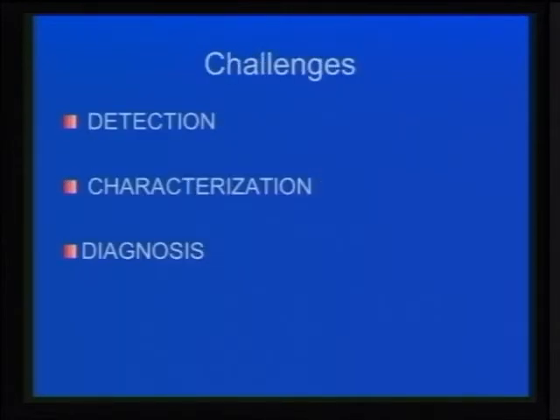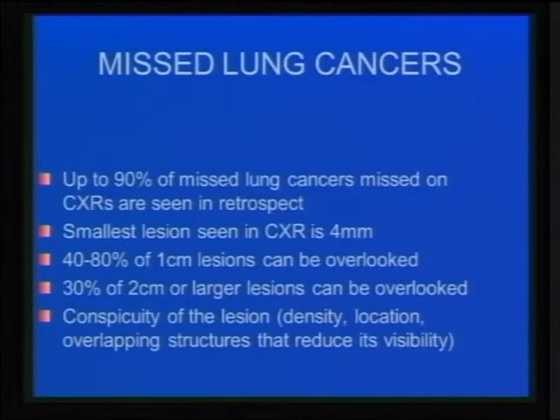So our challenge, as a radiologist, is one, to detect the nodule, so find the nodule. Once you find it, you need to characterize it. And then once you characterize it, how can you prove the diagnosis? How can you make the diagnosis? We know that the chest X-ray is a very important tool. Almost every institution throughout the world, probably 50% of their radiology volume is based on chest X-rays.